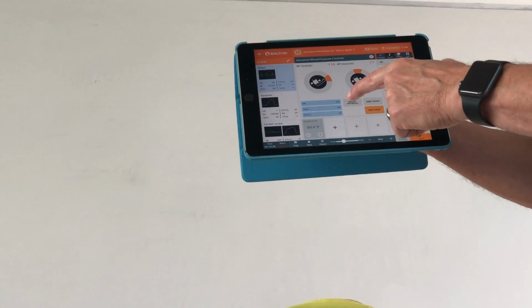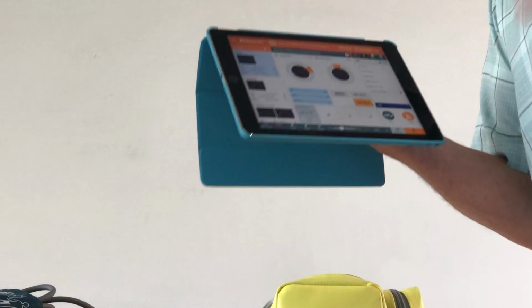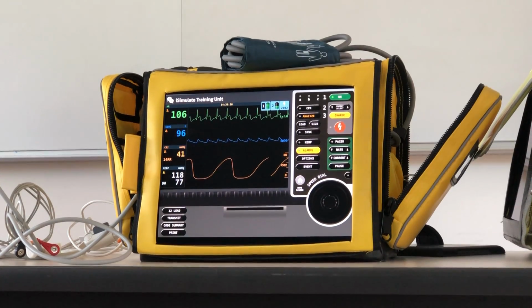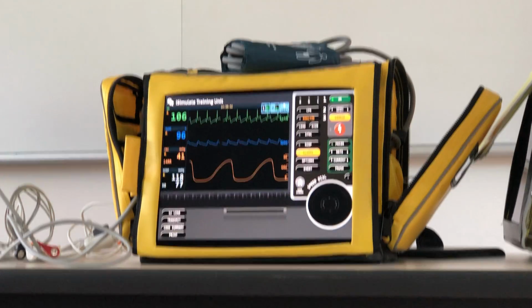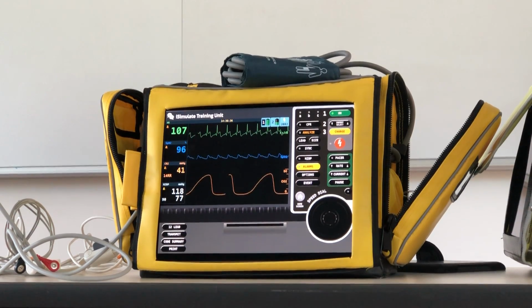So you can do that, and this is where you can also do an arterial line, which doesn't show up on this monitor, but if you're using one of the Philips hospital monitors, something like that, you can have continuous, and within that you've got about 8 waveforms to choose from if you're doing critical care kind of stuff or looking at those values.